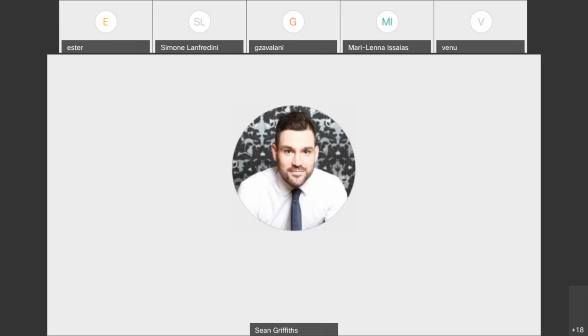We're going to dive into something a little bit more technical, which is the AI tissue classification, which was requested. And we're going to do TMAs, which is the segmentation of a whole slide image into individual TMA cores. So the most part of this training will be me doing the presentation. I might rely on my colleagues, Natasha or Ghislaine, for some images if I don't have them. But for the most part it will be me leading the presentations.